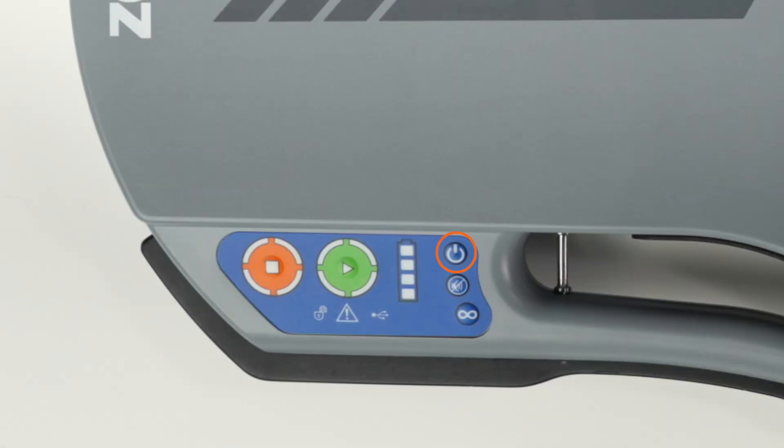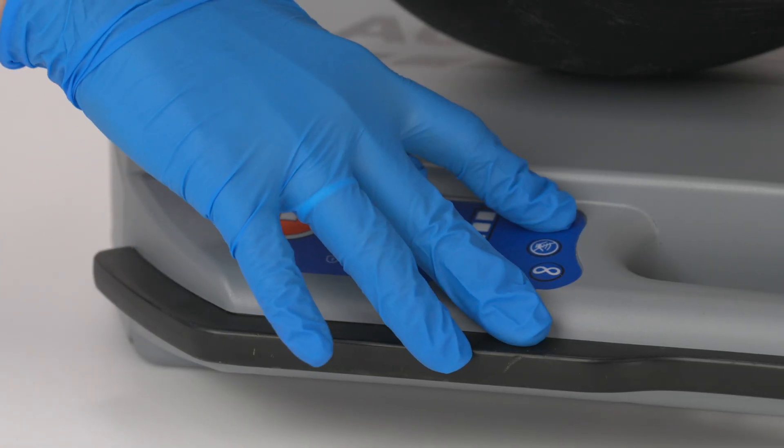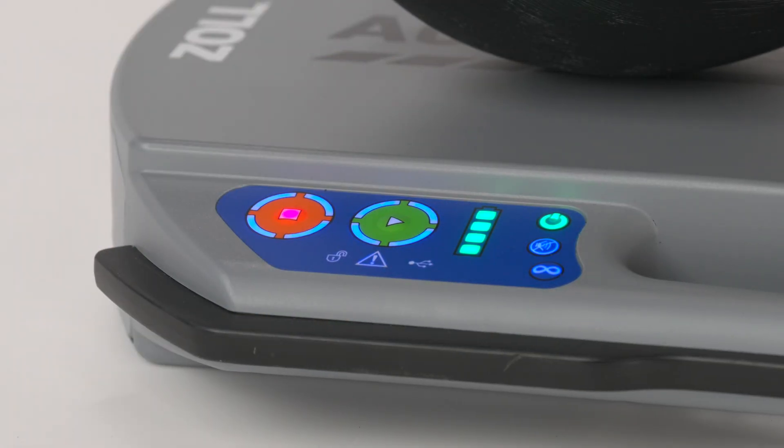The power button is located at the bottom of the user panel. Press the power button to turn the platform on or off. It illuminates green when the device is on.